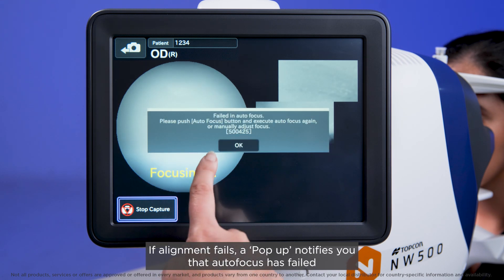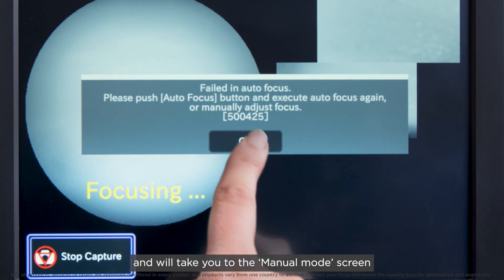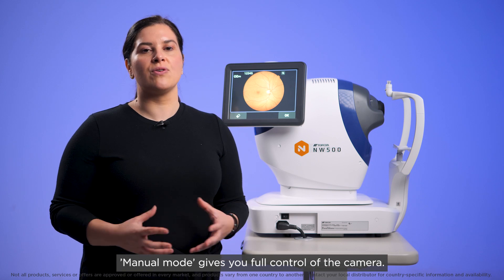If alignment fails, a pop-up notifies you that autofocus has failed and will take you to the manual mode screen. Manual mode gives you full control of the camera.